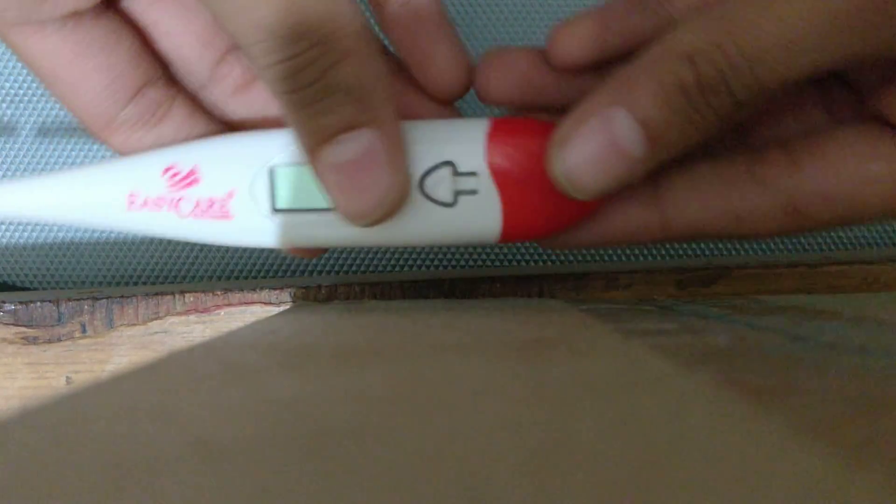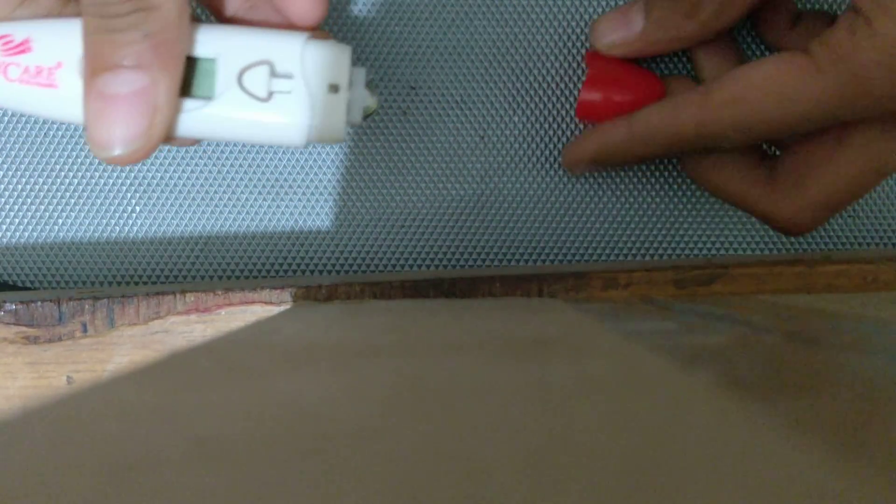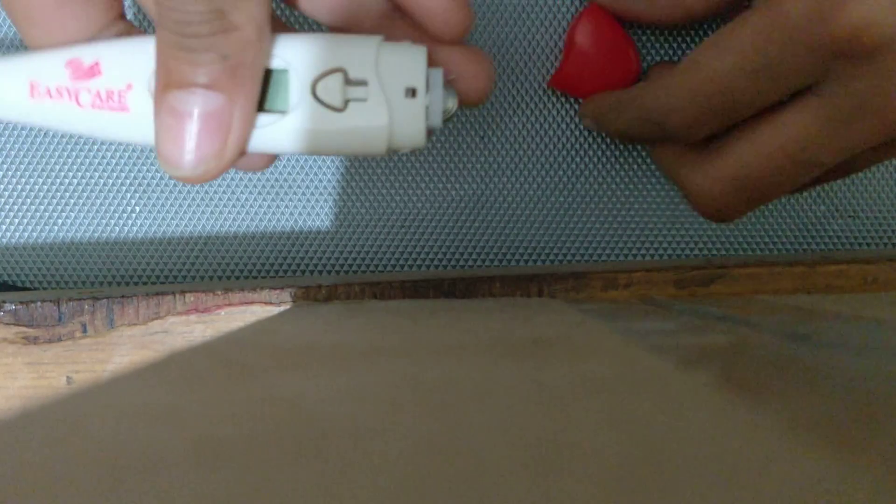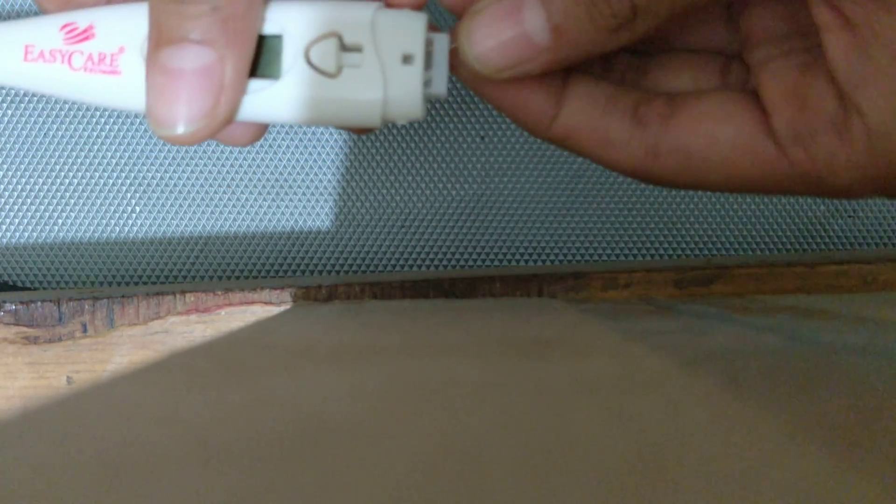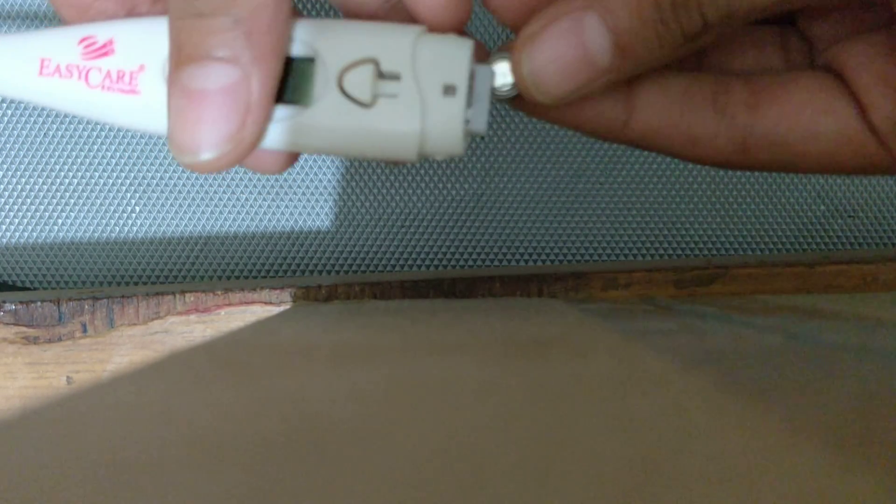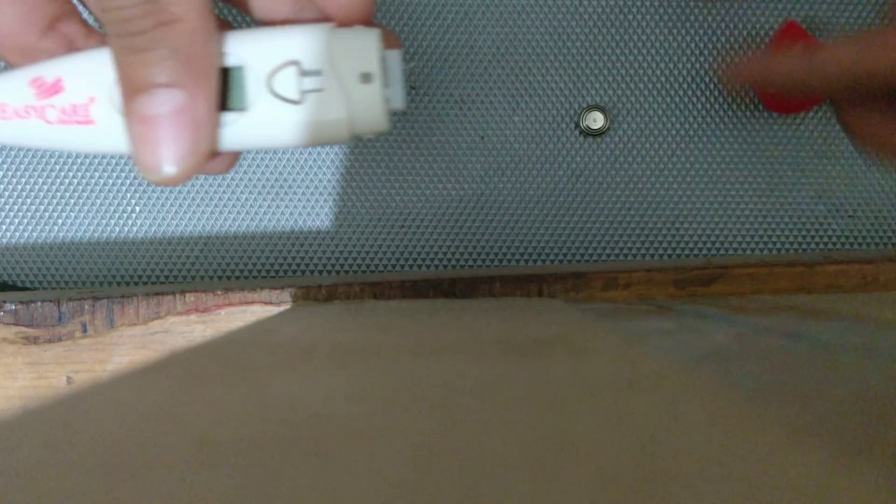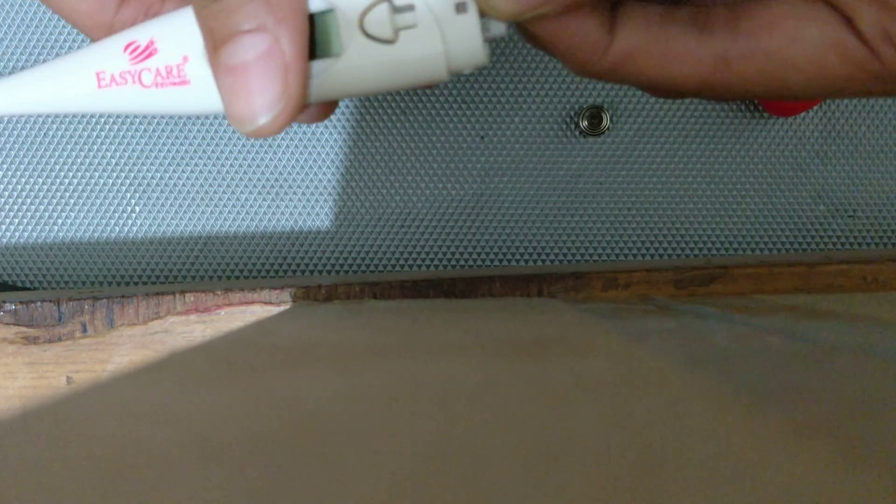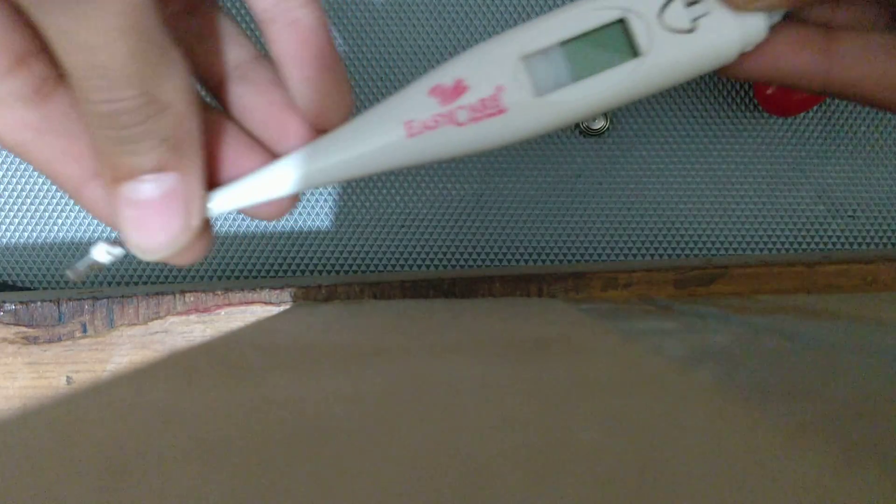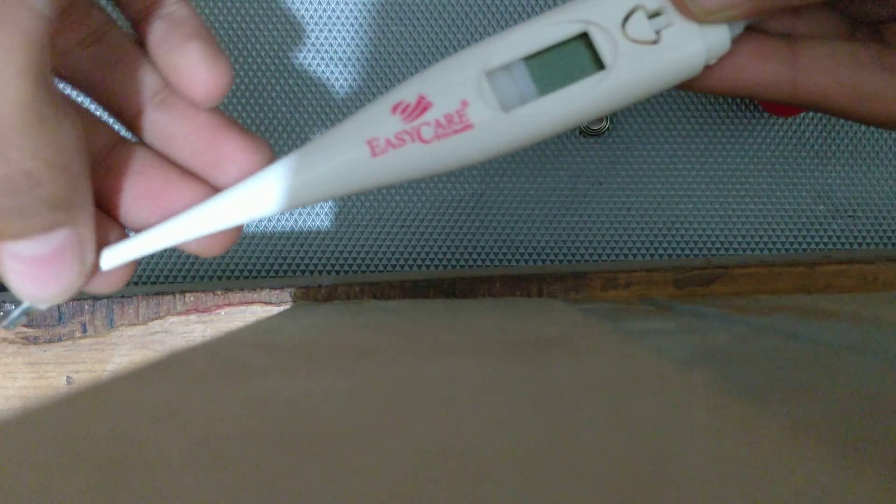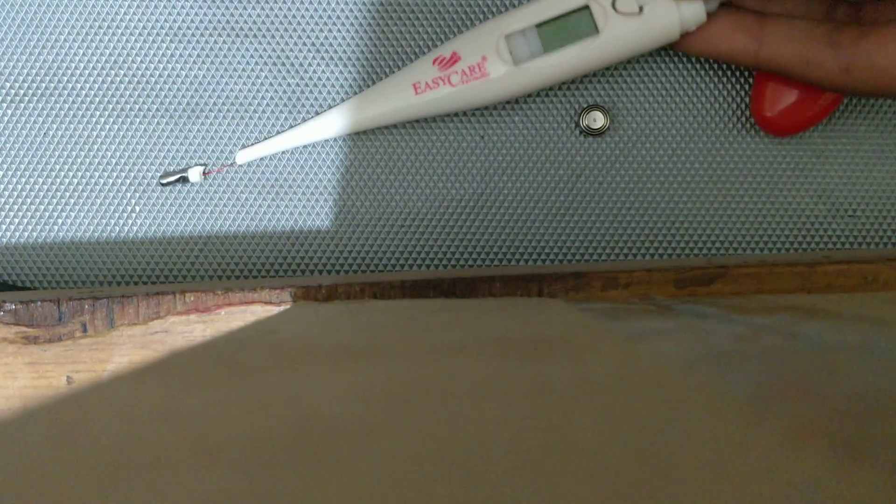First you need to remove this back cover of any digital thermometer. It is surely going to have it, and then remove the battery cell and then you can just pull this out. But before that you will have to remove this and carefully salvage it.